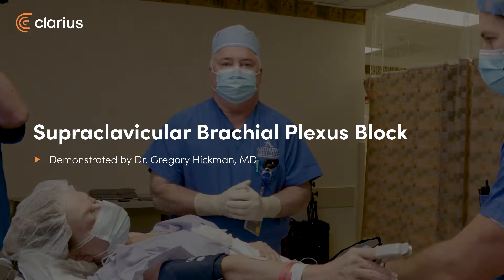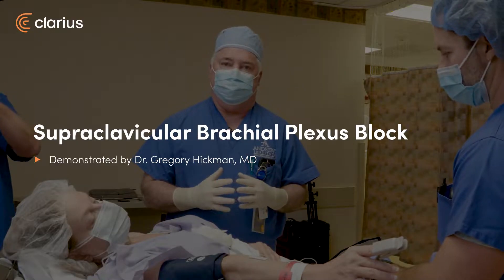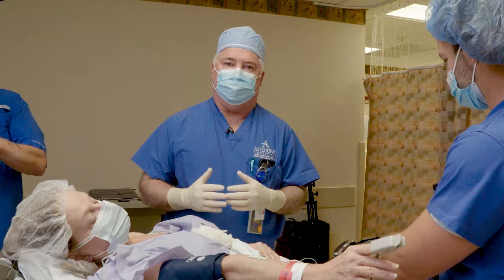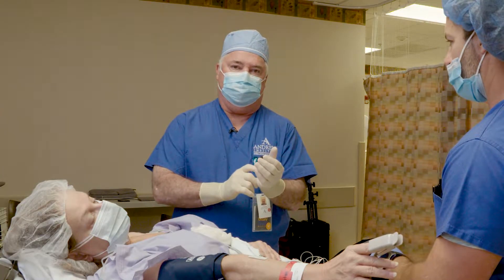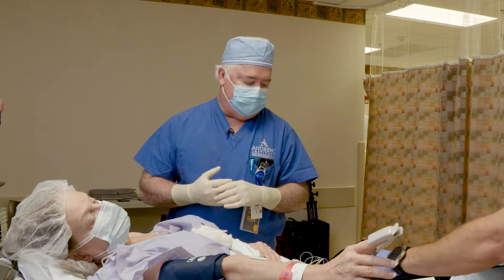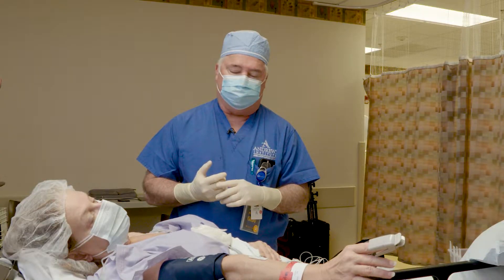This is Dr. Greg Hickman from the Andrews Institute. Today we're going to do some brachial plexus blocks, and we're going to start with a supraclavicular block. This young lady is having some elbow surgery and ulnar nerve release and a carpal tunnel release, so we're going to do a supraclavicular block.